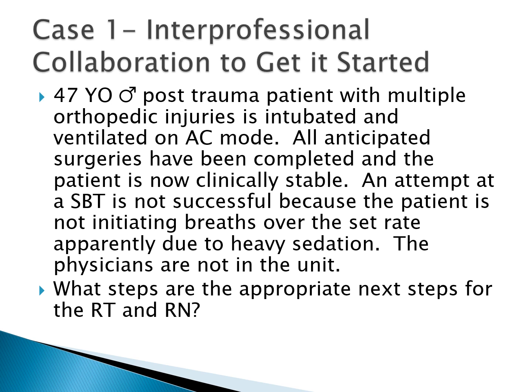The other thing we'll do is adjust the trigger. A lot of places use a flow trigger, and we typically set that at 3, but for weaning patients, we may put that down to 1.5 or 2 to make it easier for that patient, now that the sedation's wearing off and they're starting to wake up, to initiate breaths. And with the apnea interval of 30 to 60 seconds, we allow the CO2 to build up so that again they're stimulated to take a breath.